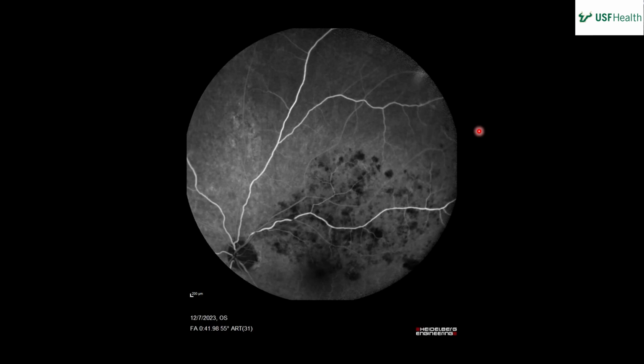And we had that last year, 2 years ago, right? Somebody had a central vein occlusion patient, and they were talking about non-perfusion ischemia, and all they were seeing was the dark. It's pretty common for it to be dark. Yeah, exactly. The other thing is, in the areas on the border, the reason the vessels are probably bigger is you've had dropout of capillary layers below them or above them, so you don't have your full capillary layers there. That area where you have capillaries is not normal. It has hypocapillaries.